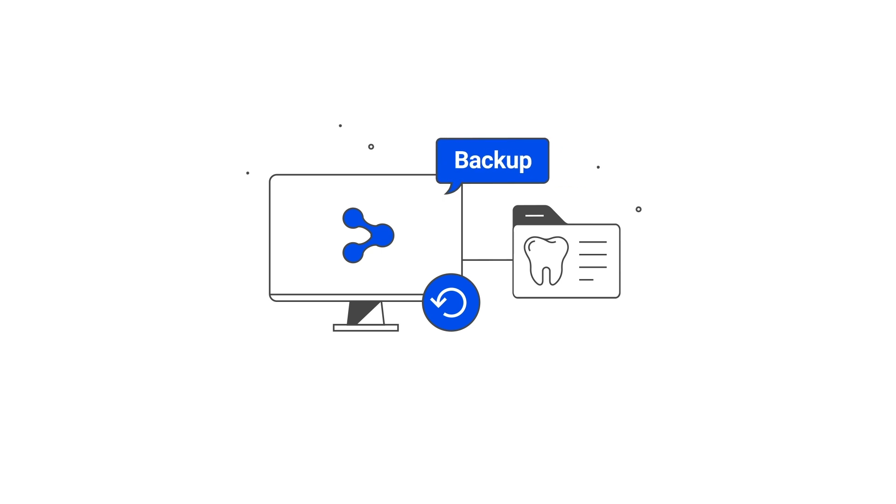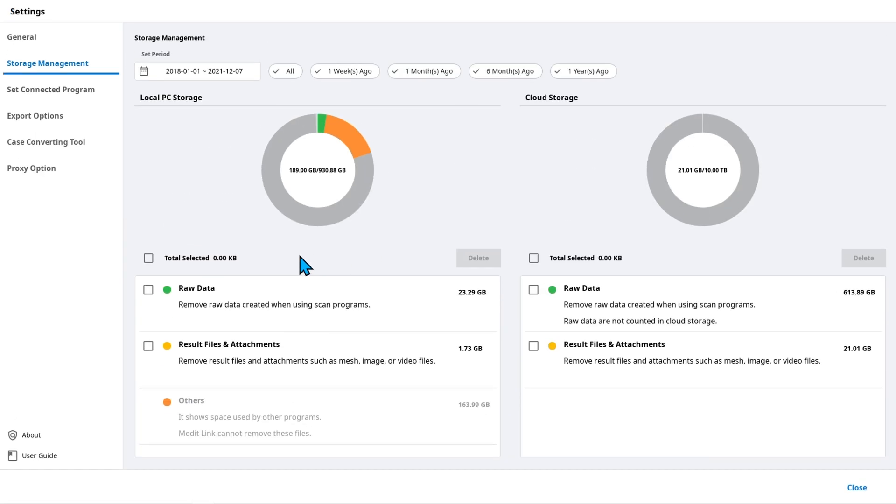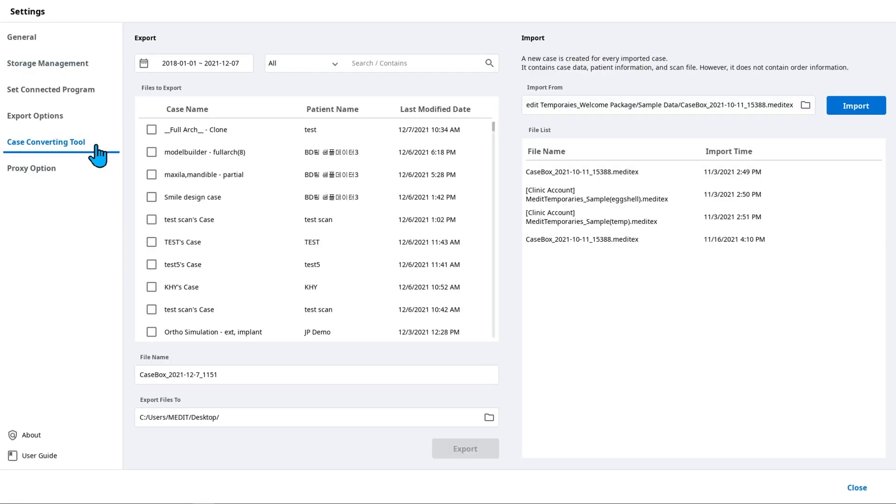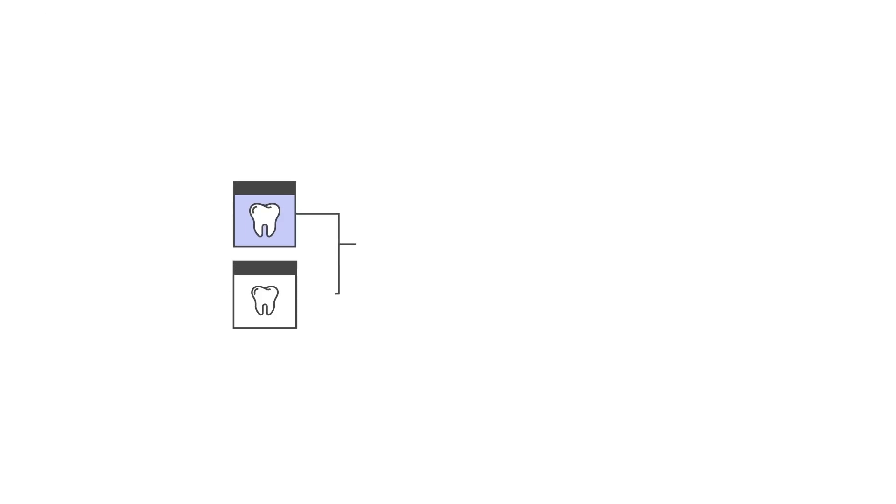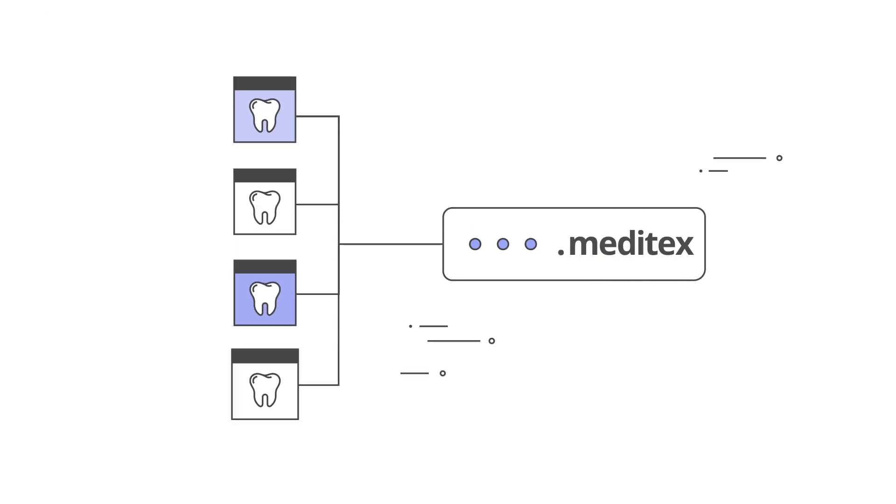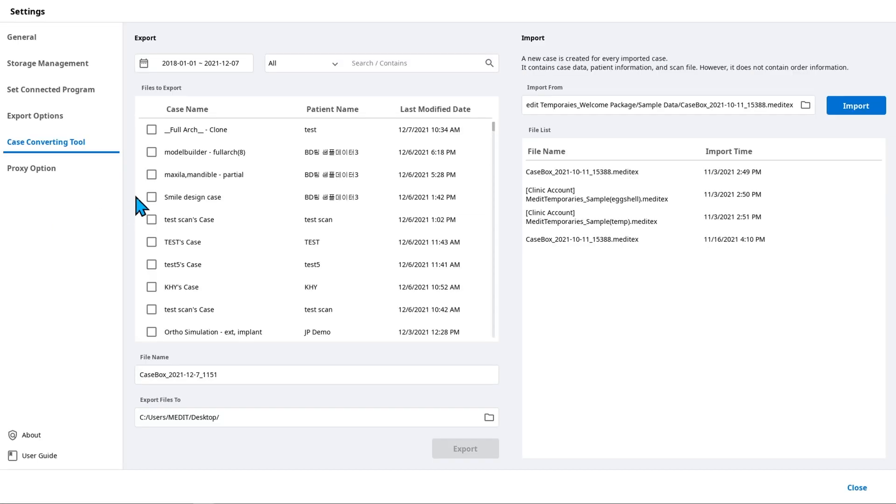If you want to ensure that no important files will be lost when cleaning up storage, you need to create a backup. Use the case converting tool to compress multiple scanned data into a single .meditex file and export it before deleting files from MeditLink.